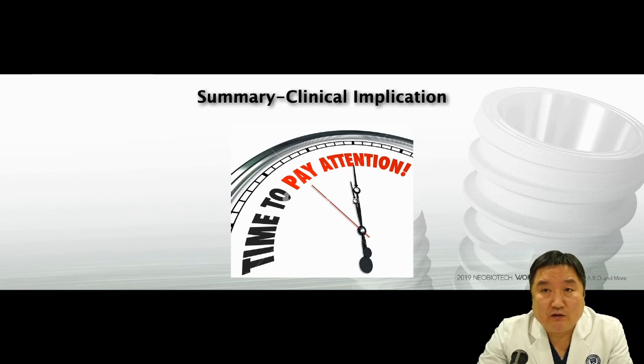So when you distribute this implant after manufacturing, you need to take care of how old it is, and how long it was kept in storage.